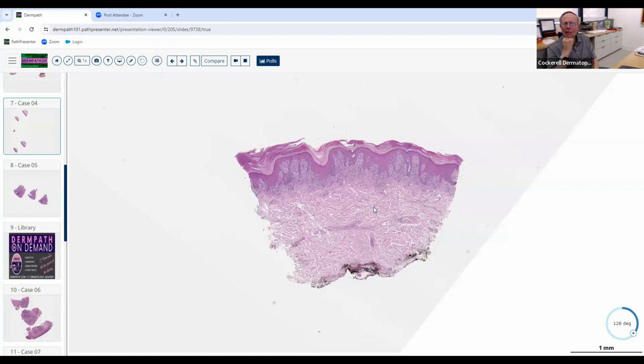Take a look at lichen planus. You didn't think this was lichen planus, did you, by chance? No, I did not. Okay, next time go back and take a look at a picture of lichen planus at low power and put this next to it, and you're going to say, I get it. Those definitely are not lymphocytes at low power. But there were lymphocytes, maybe some histiocytes. Some of them probably are histiocytes. Yeah, they're pretty pale. If they were lymphocytes, I think you should think lichen planus here. So we've got a lichenoid infiltrate with some cells in it that are not all lymphocytes.